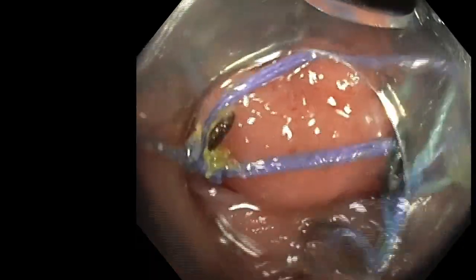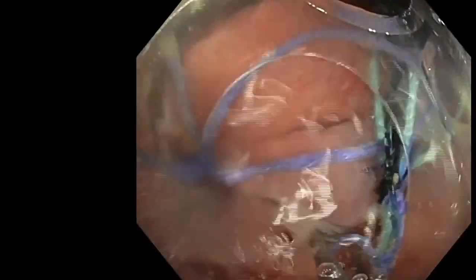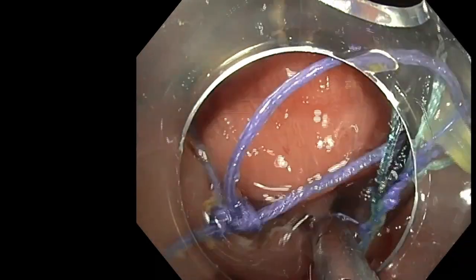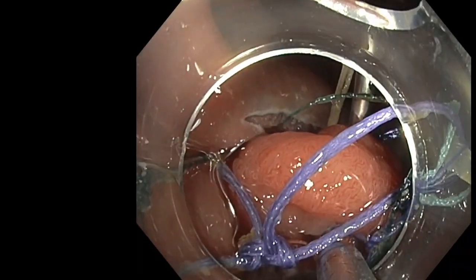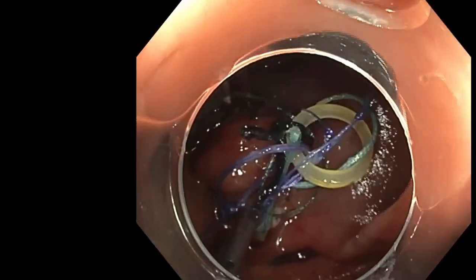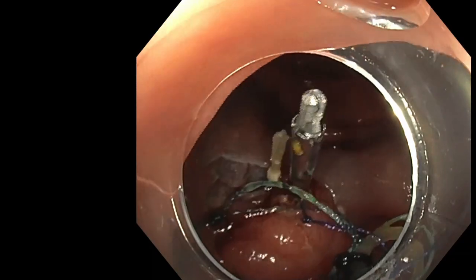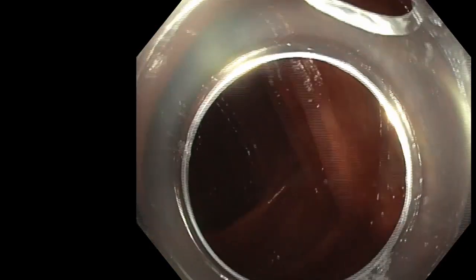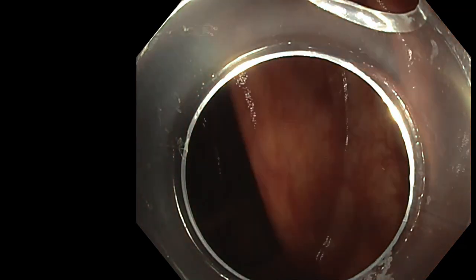So here I like to do a kind of fold with the clip because it's less damaging in case of tension. If you grasp only the edge, you can tear the specimen and cut it.